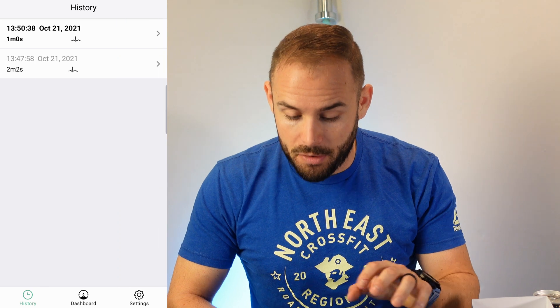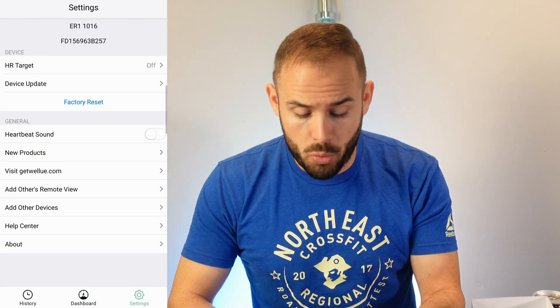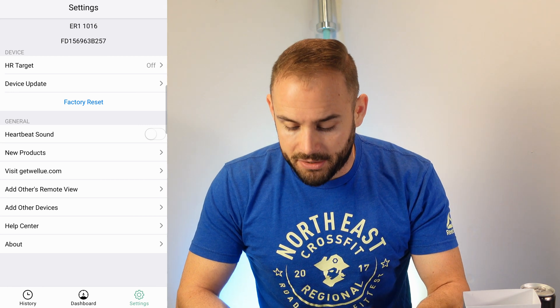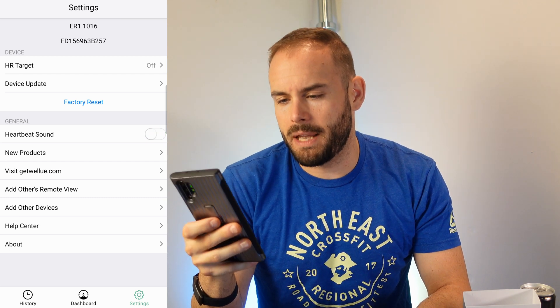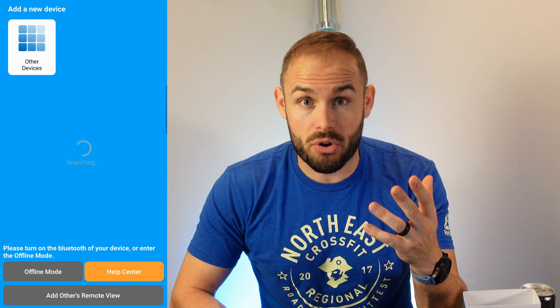You can actually record your ECG throughout the app, and you have your history showing everything recorded. When you go into that history it'll give you an idea of how your ECG was throughout each recording. Back on the dashboard, if you click over to settings you can set heart rate targets and change them if you'd like — I have that off right now, but it does have a little vibration motor to let you know what's going on. You can update the device and even change a heartbeat sound on if you want. One thing that is annoying: you do have to have the app running at all times, so if you drop out of the app it resets right from the beginning, which takes about 30 seconds to repopulate.